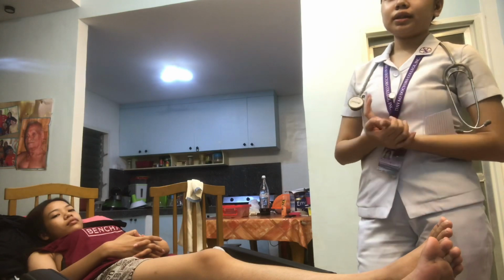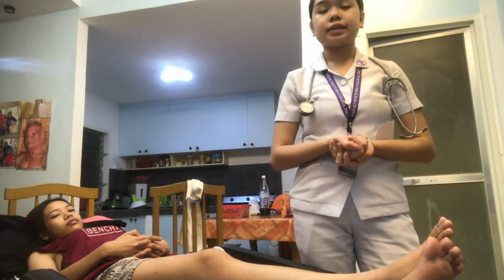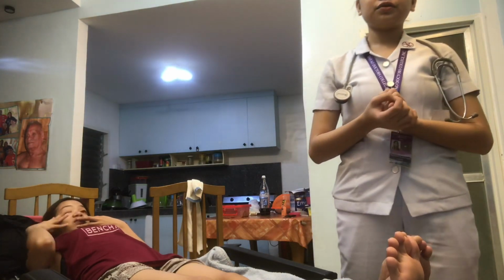Okay, thank you. Now for auscultation, turn the client's head slightly away from the side being examined. Place the bell of the stethoscope over the carotid artery. Ask the client to hold his or her breath for a moment and auscultate the carotid artery for bruits. A bruit is a blowing or swishing sound caused by turbulent blood flow through a narrowed vessel, which indicates obstructive or occlusive arterial disease.